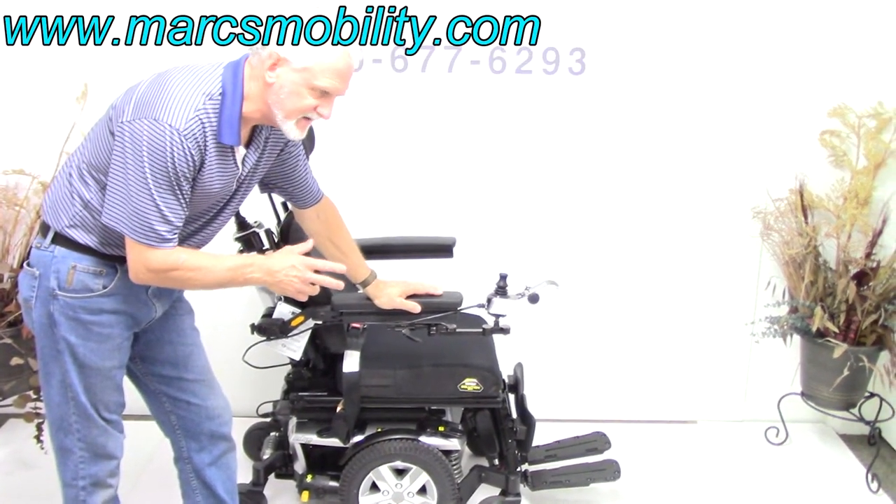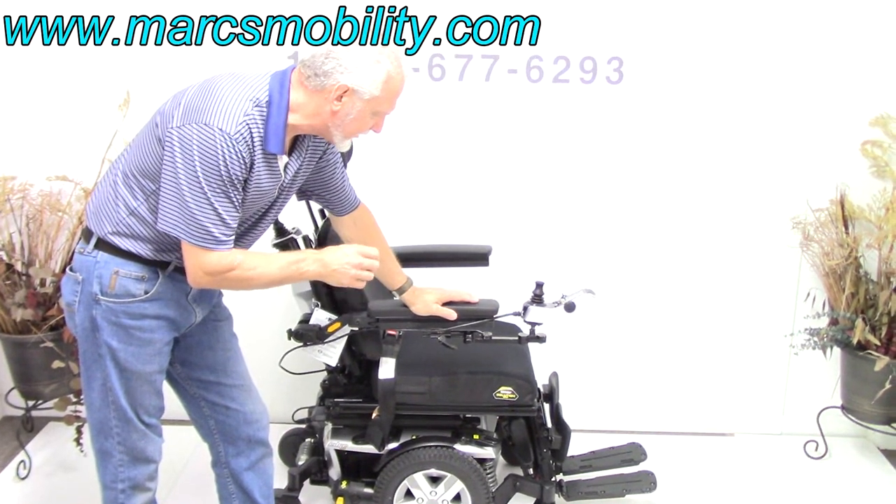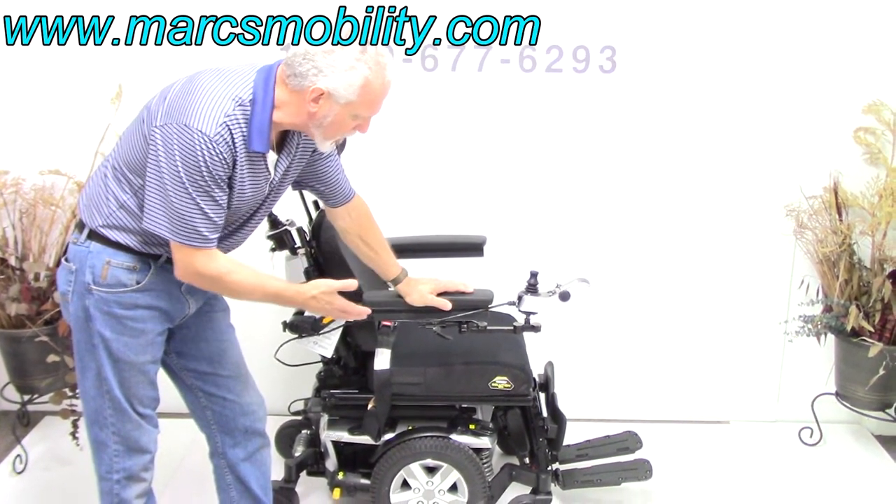This is a Quantum Q6 Edge 2.0 in almost new condition. It has 35 miles on it, so it's practically brand new, with very sharp looking colors.